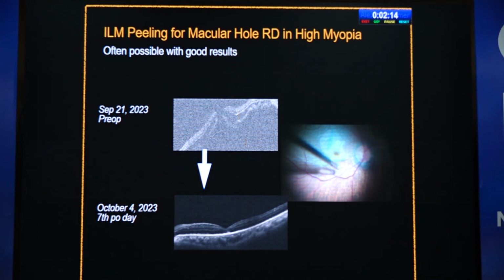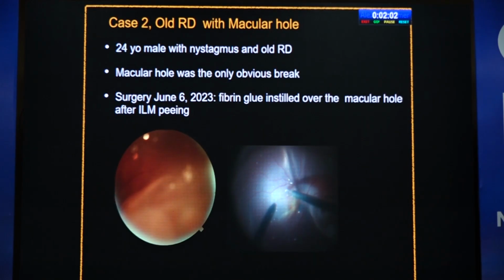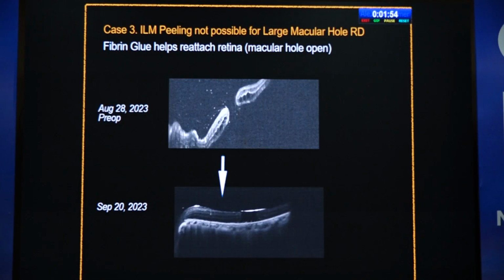Then we started extending the indications. In most of the macular hole RDs we can do an ILM peeling and the retinal detachment can settle down, but sometimes we are not able to do an ILM peel. So this was a resurgery for a macular hole RD, and we injected fibrin over the macular hole. So both are closed and attached. Similarly, an old RD with a macular hole. The hole is closed and the retina is attached, and within 6 days the glue is gone.